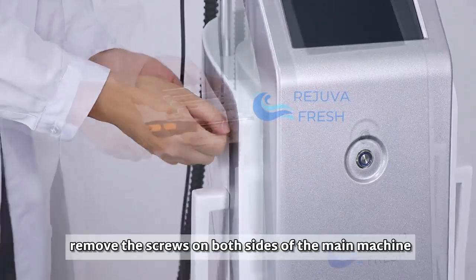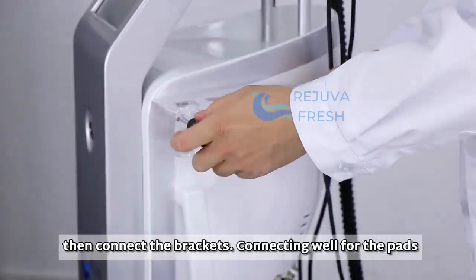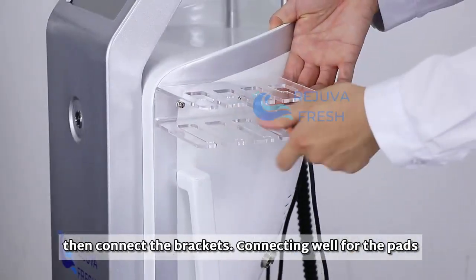Second step: remove the screws on both sides of the main machine, then connect the brackets, connecting well for the pads.